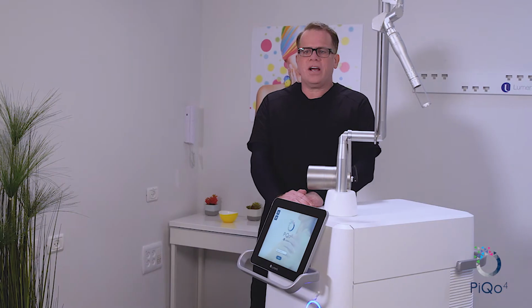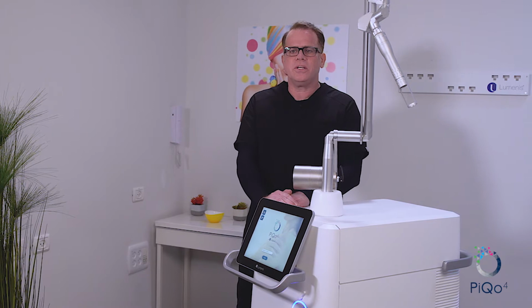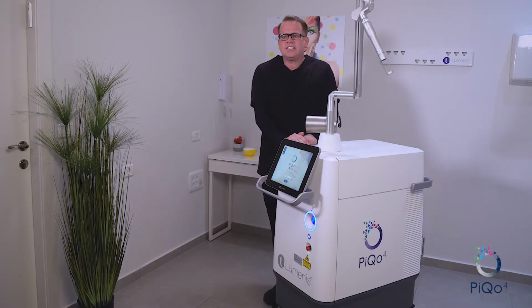The PicoFractional generates laser-induced optical breakdown. By doing so, there is a controlled insult that triggers the desired rejuvenation effect. Additionally, it leaves the skin intact, which allows us to foster accelerated healing. The visual clinical endpoint is a mild to moderate reddening. The slight inflammation is intentionally created to further the collagen generation.